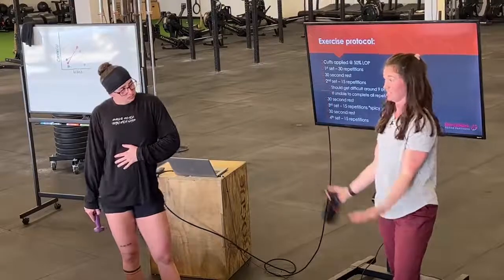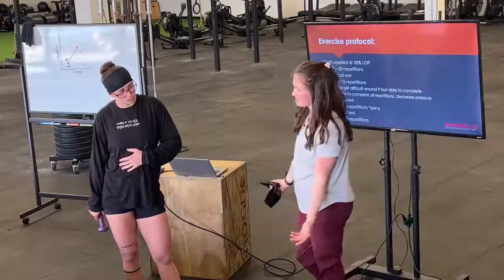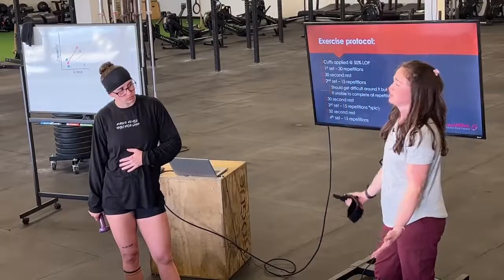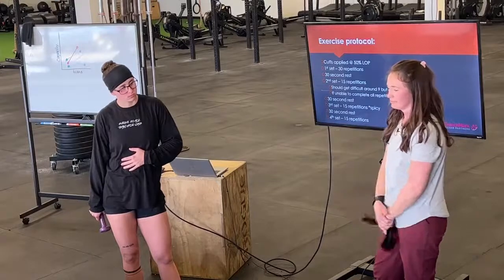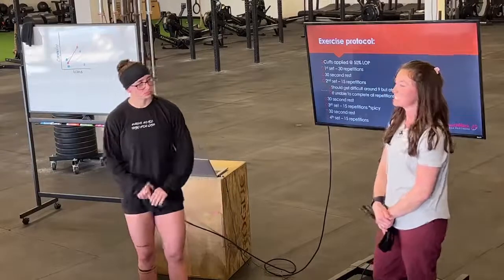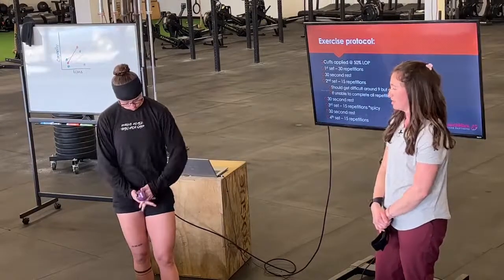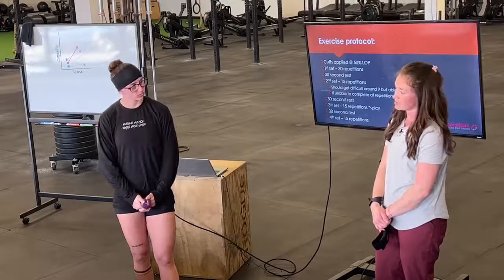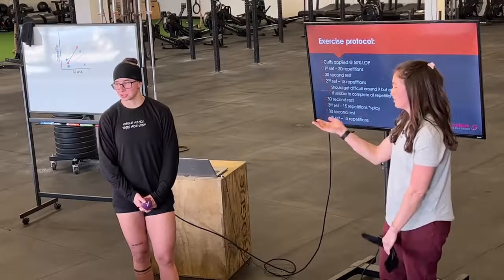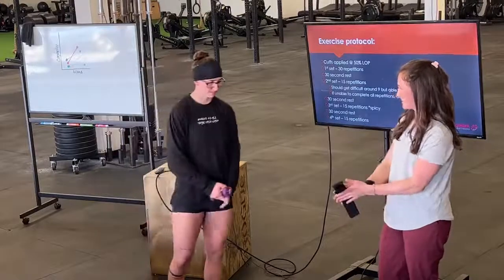Last night I was testing it on Kevin and I was having him do it with the side that we weren't occluding, and I think he noticed more of a difference too. Another thing to consider is weight-bearing positions are sometimes going to be more effective for strengthening. So thinking about push-ups, squats, closed chain exercises, but just for demonstration purposes, I wanted to keep it simple. So good job. Thanks.